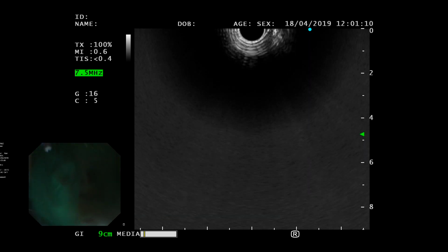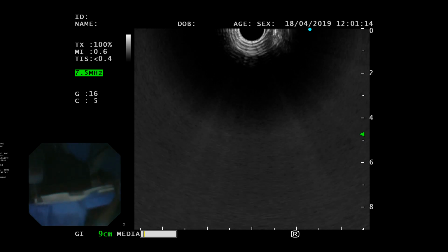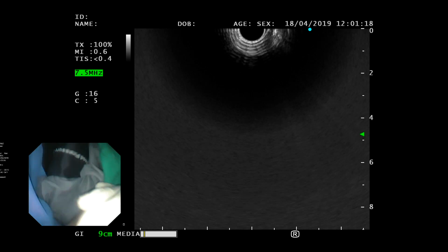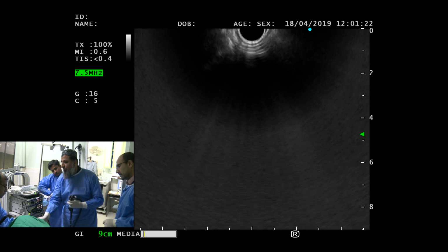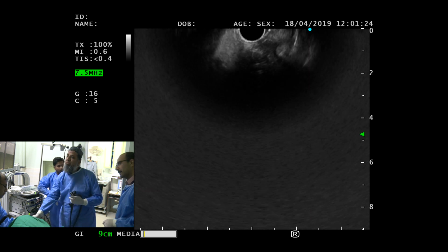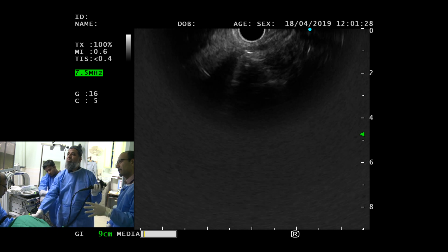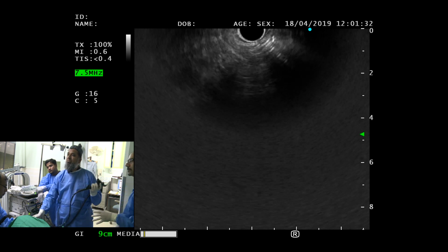I'm going to let you try one more time. So you have to have it at about 90 degrees, okay? So try that. So thumb down even more. There. Okay, relax. Relax your big wheel. And it should just slide in easily. Are we through? Good.